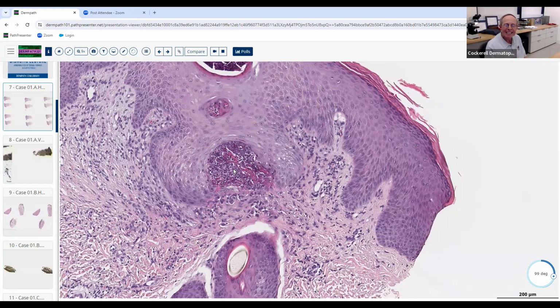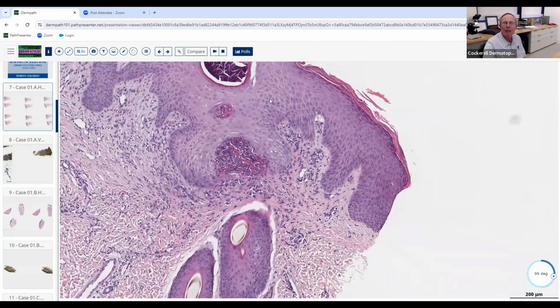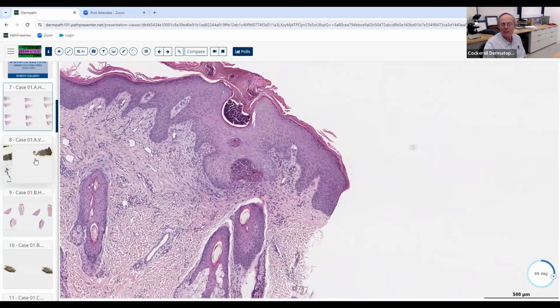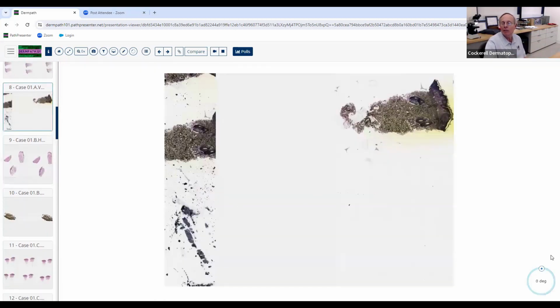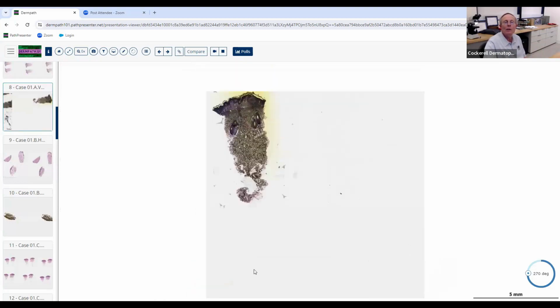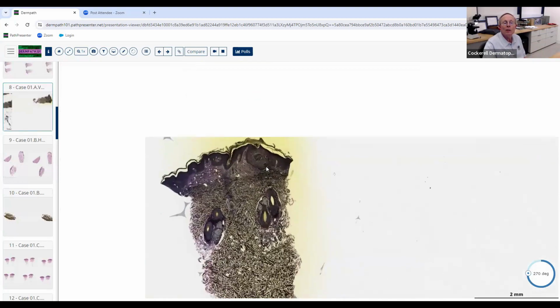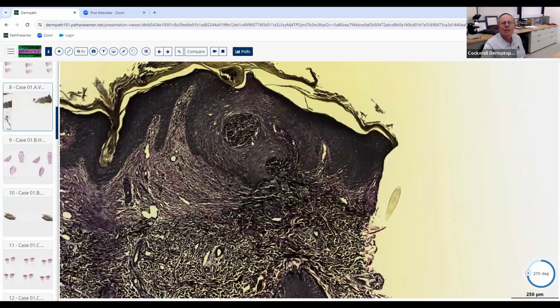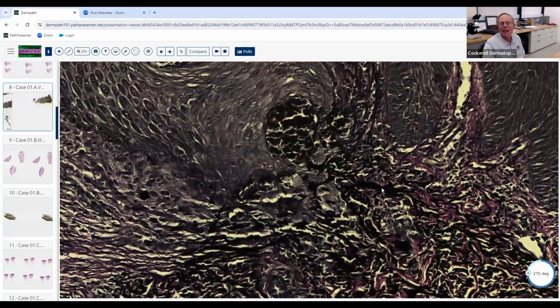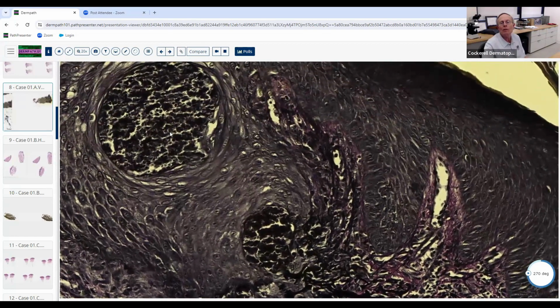These are not spontaneous diseases. They have to be doing something to their epidermis. Patients with Down syndrome, they like to rub and scratch their skin. And so basically they end up getting the lesions secondary to that, and they may not have any kidney failure. So here's the elastic tissue stain. It's really pretty dark, but you can see a lot of these dark black structures here. They're elastic fibers that are degenerated and getting ready to be transepidermally eliminated out of this acanthotic epidermis here.